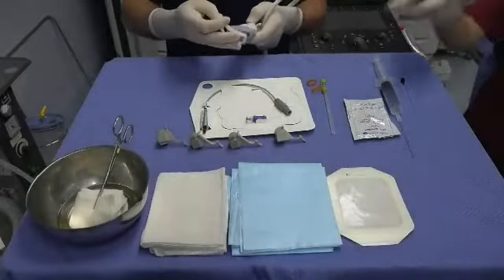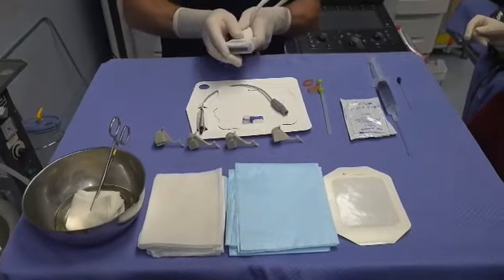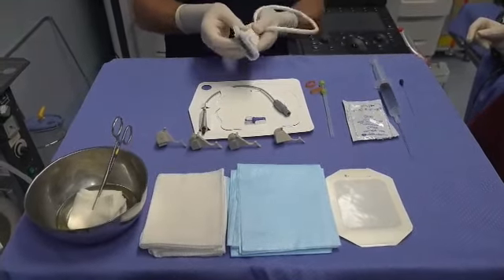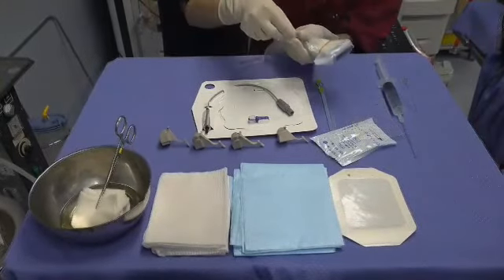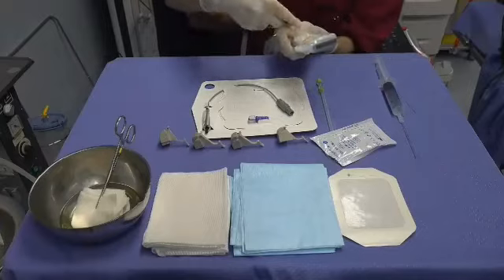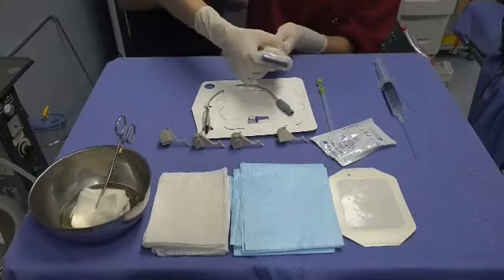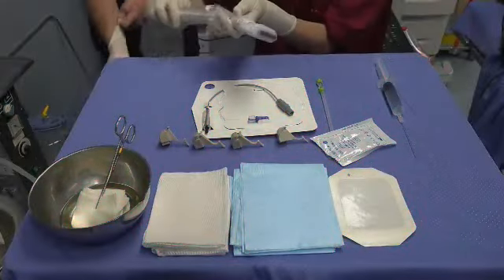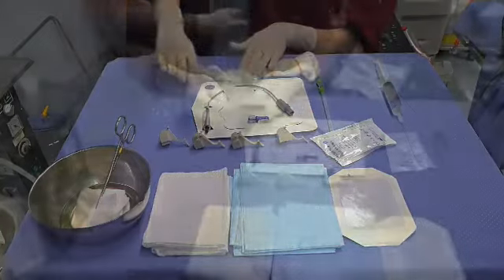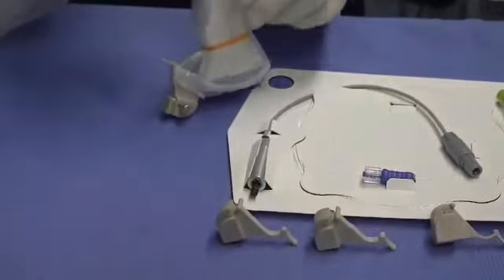The bracket is placed on the ultrasound probe and then covered by the sterile protective cover. The guide is placed on the bracket. The angle is decided during the programme.